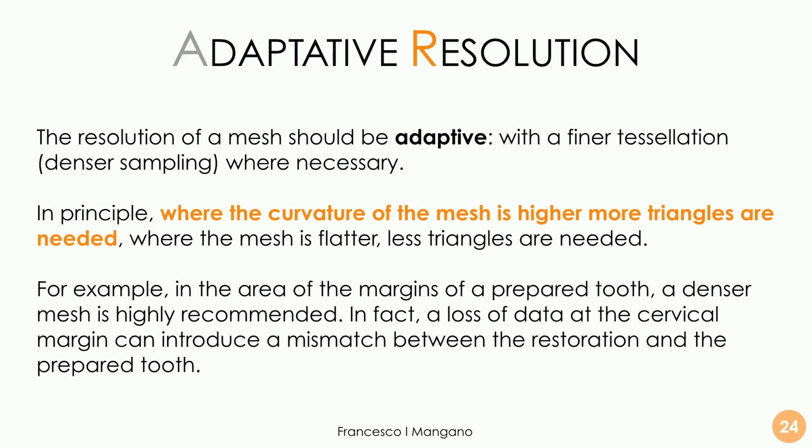Once again, the critical area is the area of the margin line of the prepared teeth, because here a denser mesh is highly recommended in order to gather more data and to transfer the data to the dental technician who needs, in the computer-assisted design software, to draw the margin line. It's key. It's very important in order not to make errors, mistakes, and not introduce mismatches.